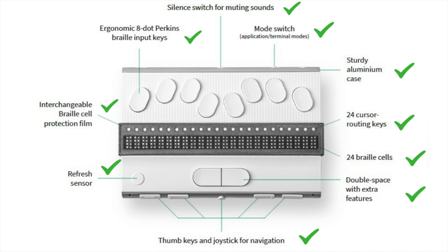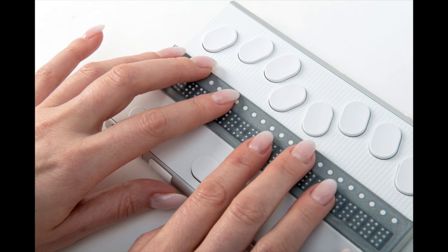Most of the data in application mode is kept in BraillePen 24's internal memory and synchronized with the data on the server when the data on the server or on the device changes. BraillePen 24 uses an internet connection on a mobile device to maintain this functionality. A BraillePenSync app must be installed on the mobile device, paired with BraillePen 24, and logged into one or more servers, IMAP or Gmail. The following operations on the IMAP or Gmail server data are performed.